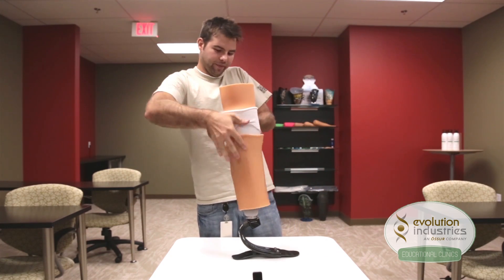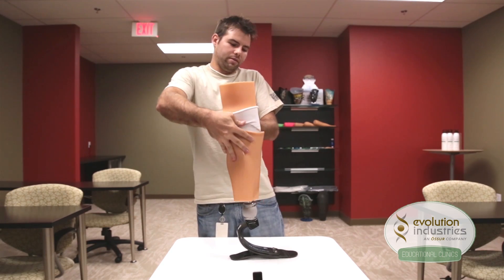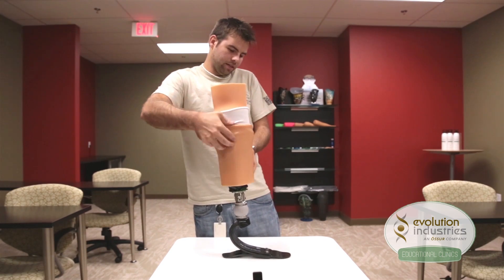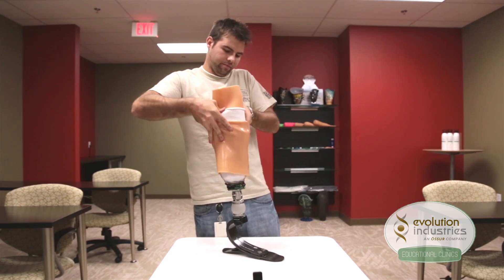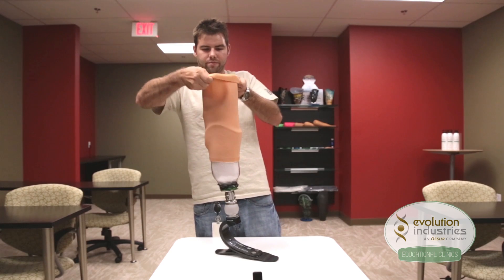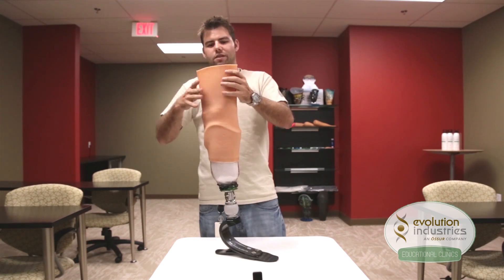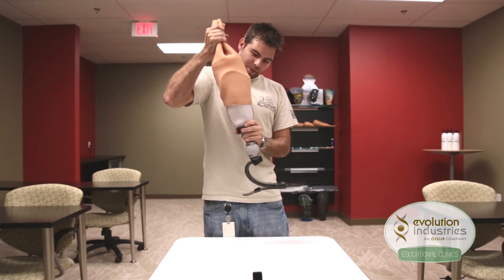Once the patient is in, have them roll up their sleeve. Once the sleeve seals to the liner, it should be held in suspension.